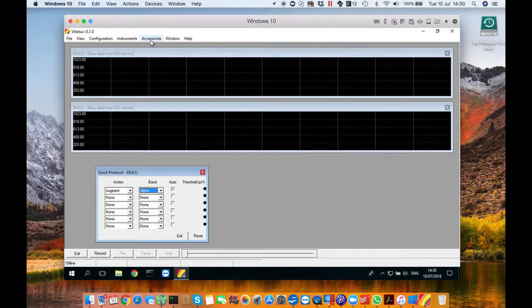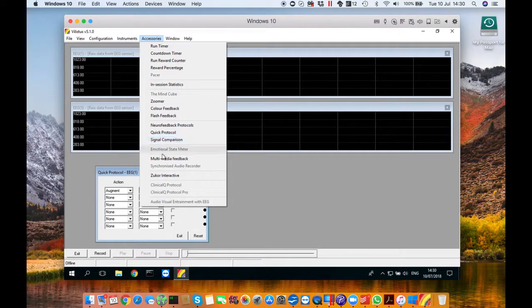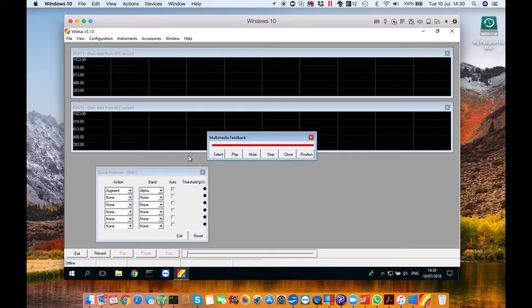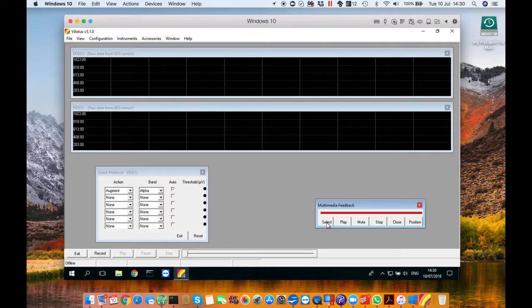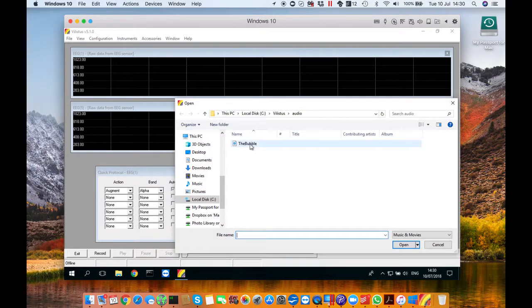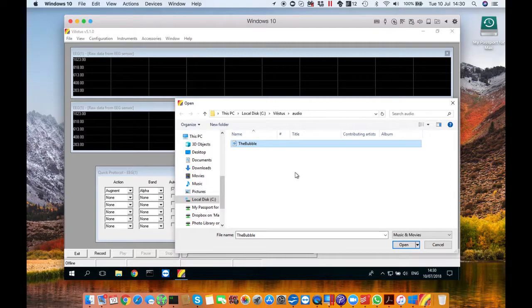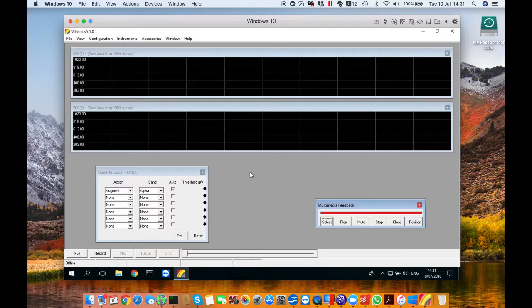Then go to accessories multimedia feedback and a little window will appear. You can place it wherever you want. Click select. This is where you get to choose the music that you want to listen to during the session and press open. You're now ready to get started.